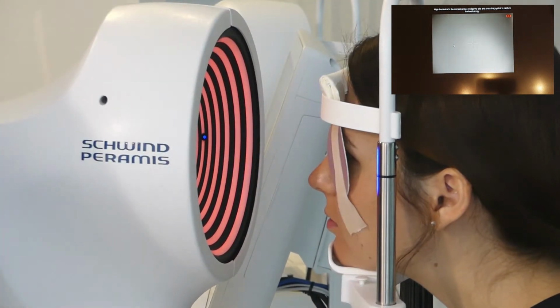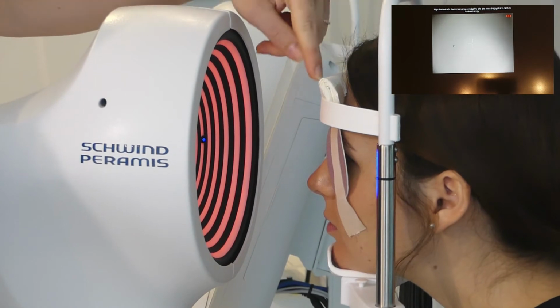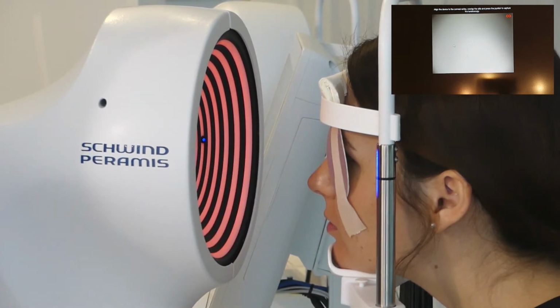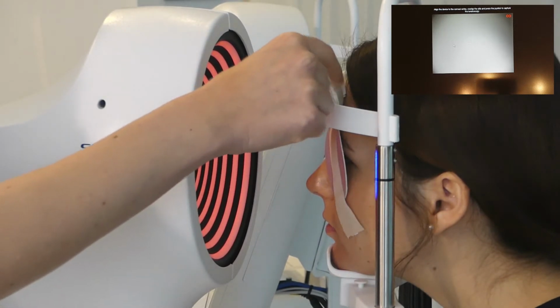Okay, currently my patient is looking straight. The aim of this spacer here is to tilt the head of the patient to avoid shadow that comes from the orbita, especially when you have patients with deep set eyes. It's very important to position the spacer here.